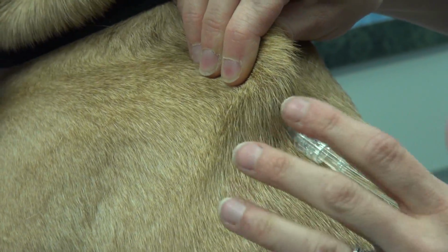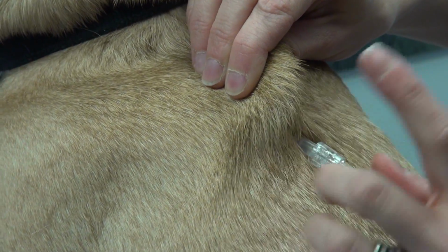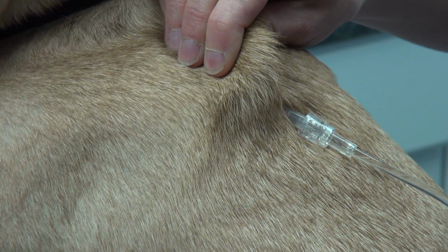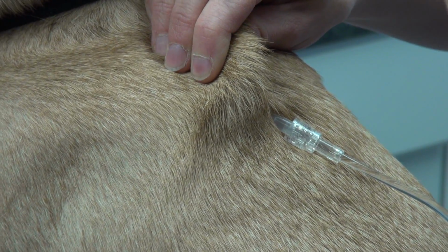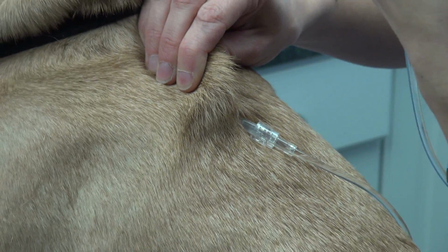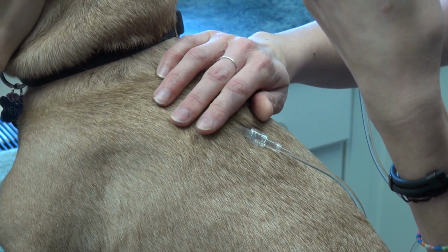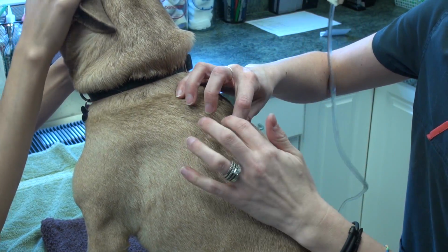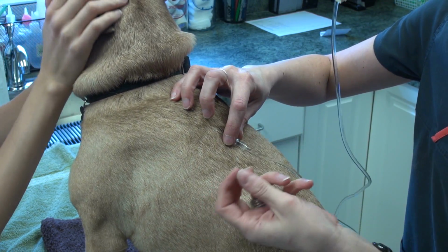They're gonna jump like that. They honestly jump more when the fluids start flowing than when you poke the needle in. That's normal, because it feels a little funny. And now I'm just gonna unroll this, and then the fluids are gonna start flowing in. And you just kind of want to hold this in there, because if they do move or they flail, it could cause irritation under the skin.